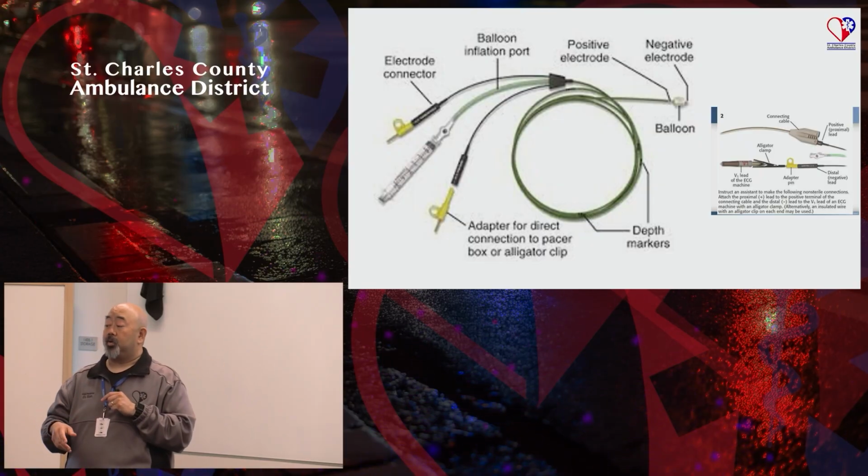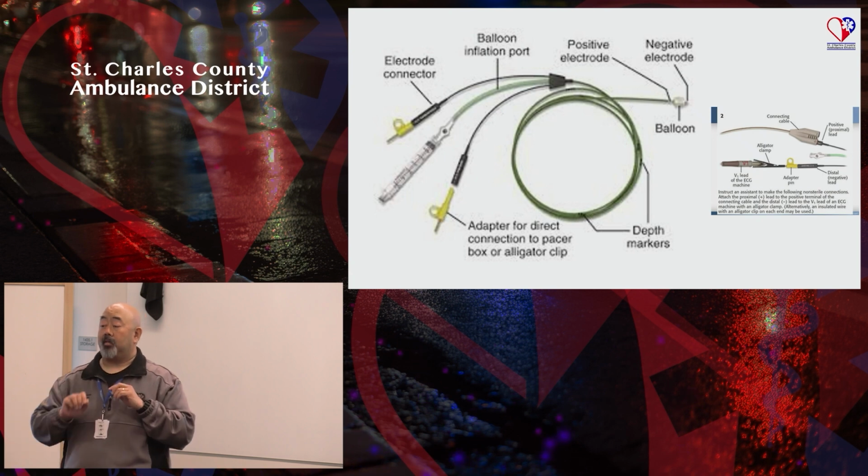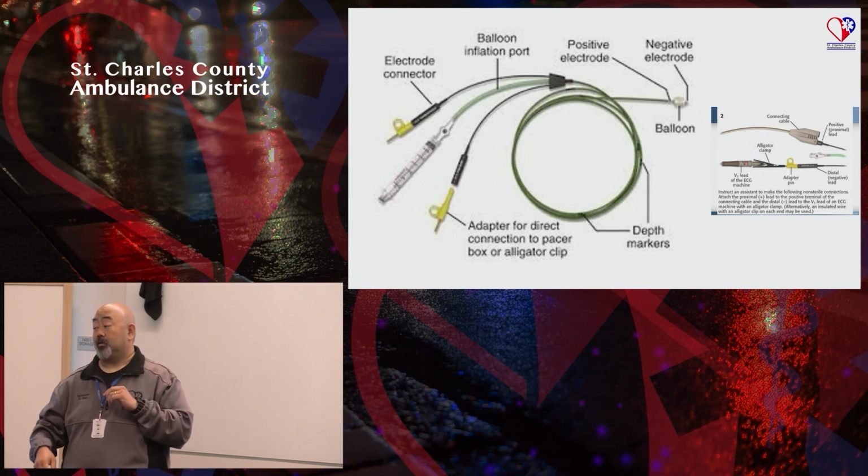So same kind of idea. Once you're in the vessel, you can inflate the balloon. It helps take it through the right atrium into the right ventricle. Easy.